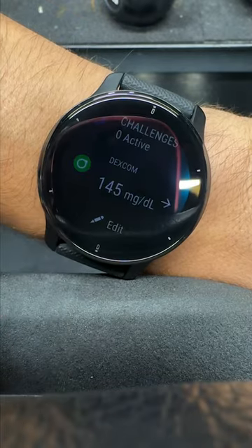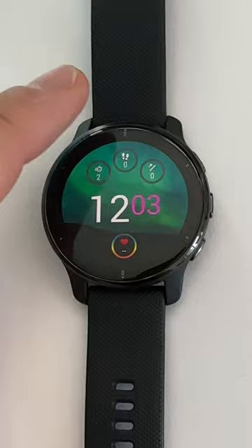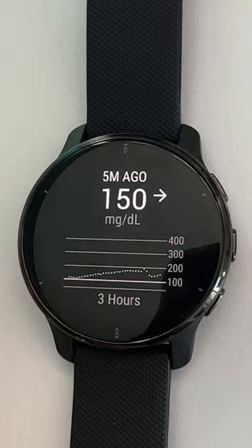Garmin watches can display blood sugar readings in a few different ways. Here's what I've tried. I placed a widget on the home screen. By swiping down, I can see my number and tap in for a more detailed look at my levels. It's a three-hour graph. Currently, you can't customize the chart height or time length.